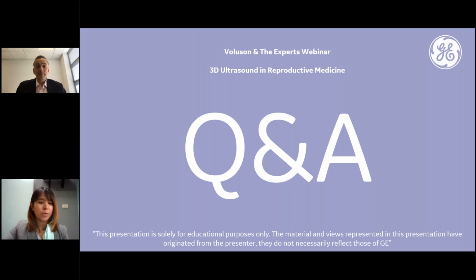So you always use the multiplanar function? I'm a big fan of it. A lot of my staff, we have a lot of nurses that scan in my unit, and when they come to show me a picture, I'll be doing the meeting after this, so I'll review all the scans in the morning, and often they show me pictures of, is it a polyp? You know, all these questions we've been discussing. And many of the images are rendered. They show me the picture with the render on, and I immediately tell them off and take it off.